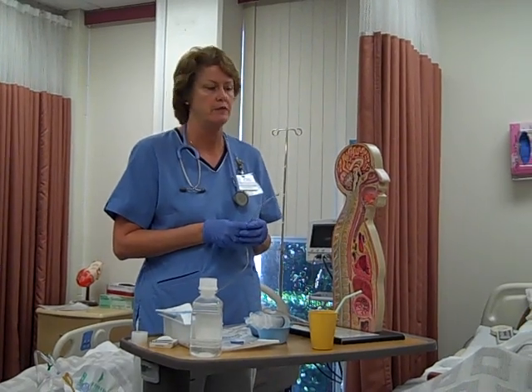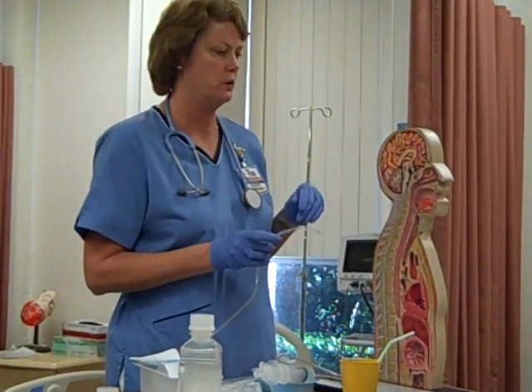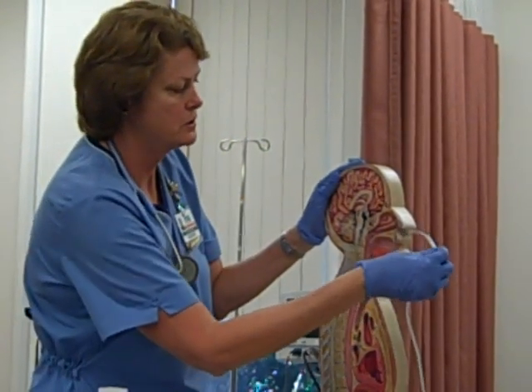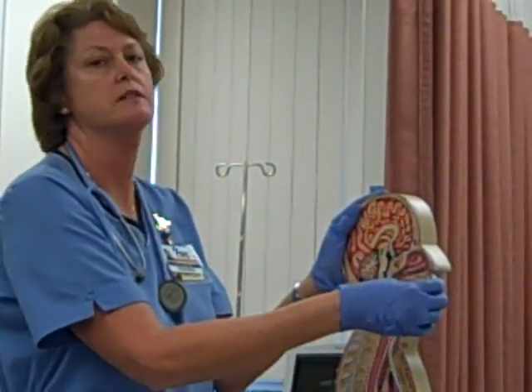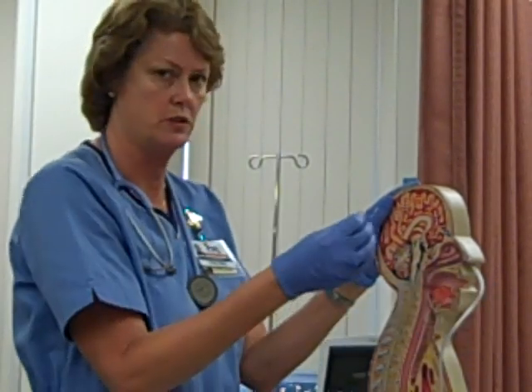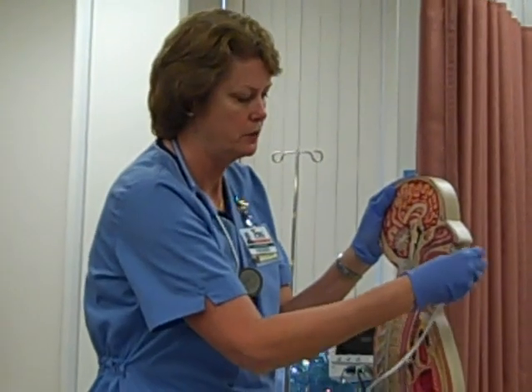When we first start, we're going to have the head of the bed up. It's probably a good idea to take the pillow out from under their head — their head is going to be extended backward. So you have the patient's head back with the tube all lubricated up, and you insert the tube until you come to a dead end at the back of the oral pharynx. Then have the patient bend their head forward, have your helper bring the water, and tell the patient to start drinking. As they drink and swallow, you push the tube down with each swallow — it will go in much, much easier.